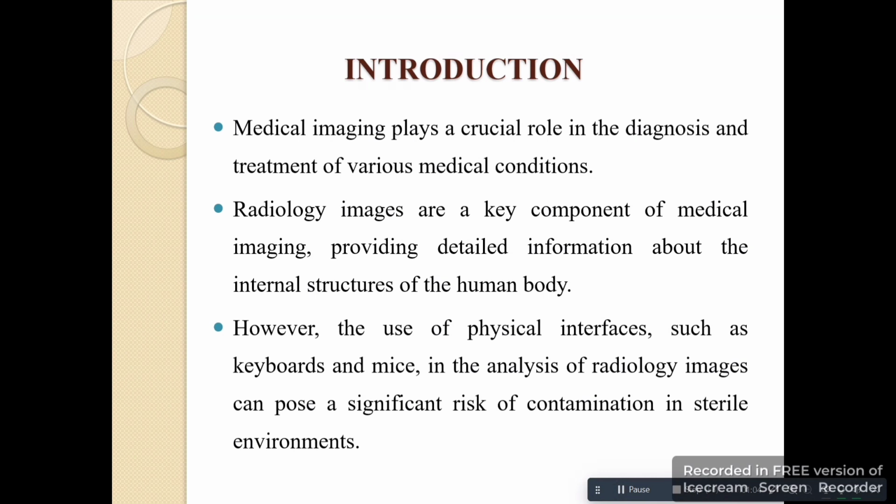analysis. Introduction: medical imaging plays a crucial role in the diagnosis and treatment of various medical conditions. Radiology images are a key component of medical imaging, providing detailed information about the internal structure of the human body. However, the use of physical interfaces such as keyboards and mice in the analysis of radiology images can pose a significant risk of contamination in sterile environments.